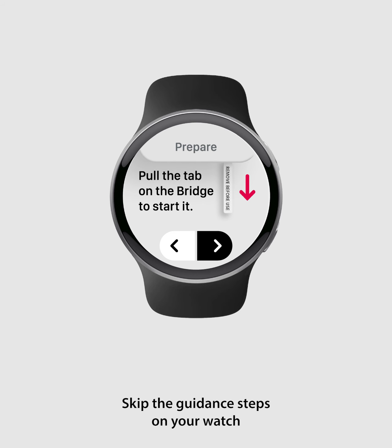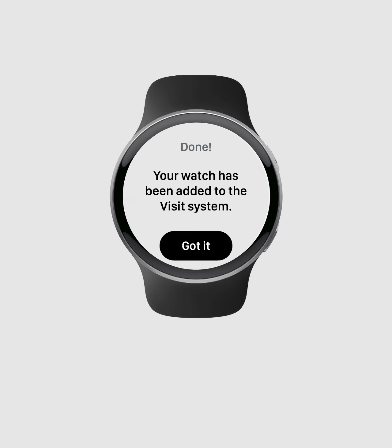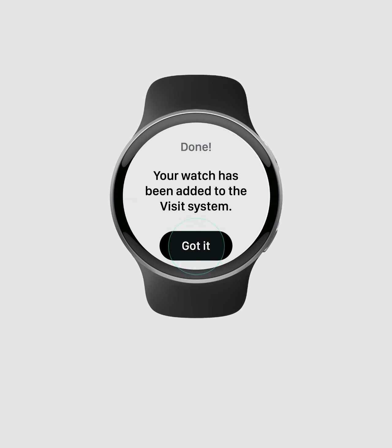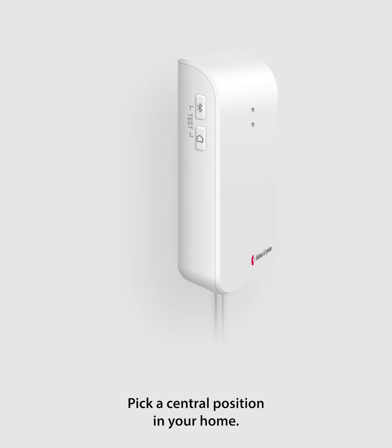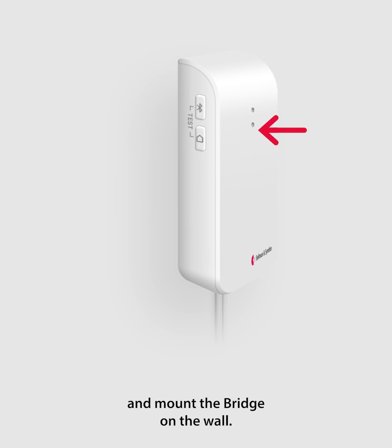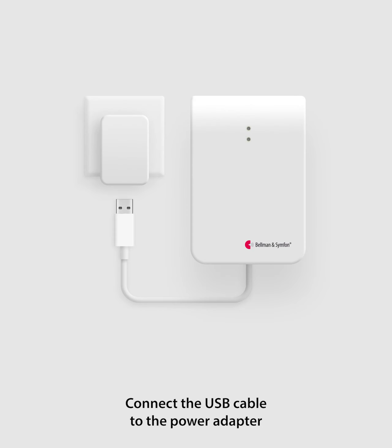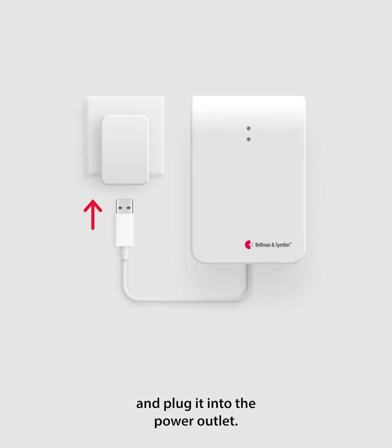Skip the guidance steps on your watch by tapping the forward button until it tells you that you're done. Pick a central position in your home, remove the cover from the Velcro, and mount the bridge on the wall.